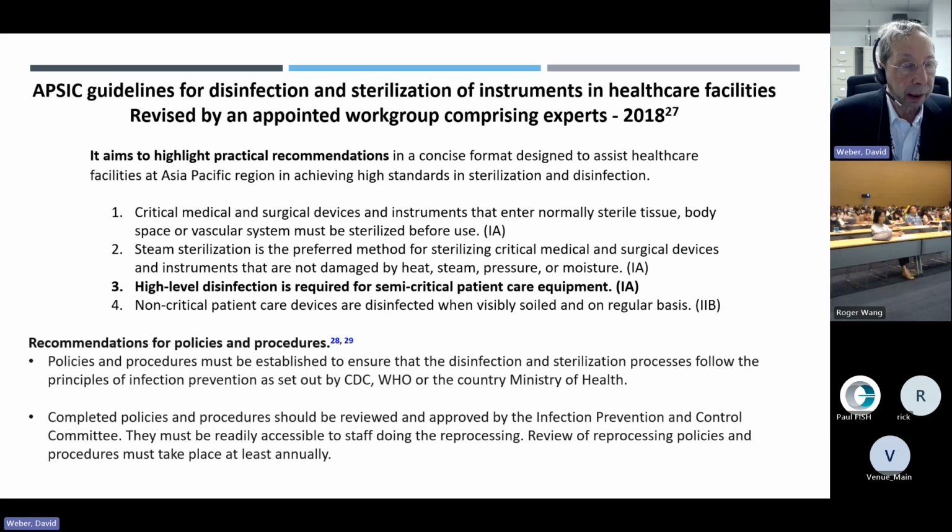They note in the guideline that high-level disinfection is required for all semi-critical patient care items. That would include all endocavity ultrasound probes. Non-critical patient care items are disinfected when visibly soiled and on a regular basis, such as surfaces in hospital rooms.